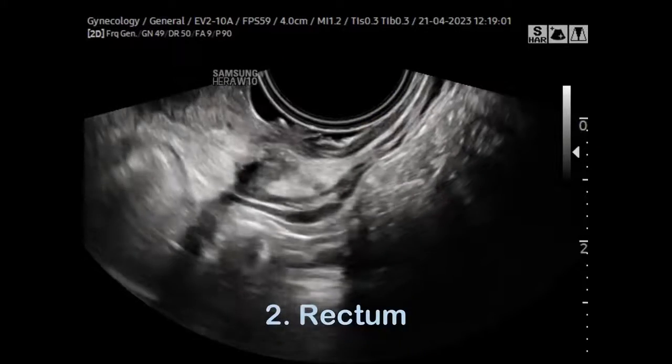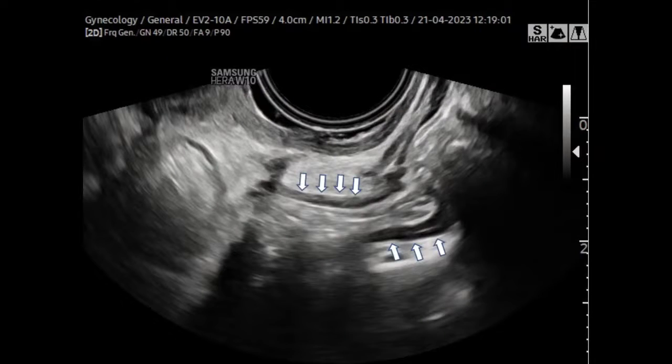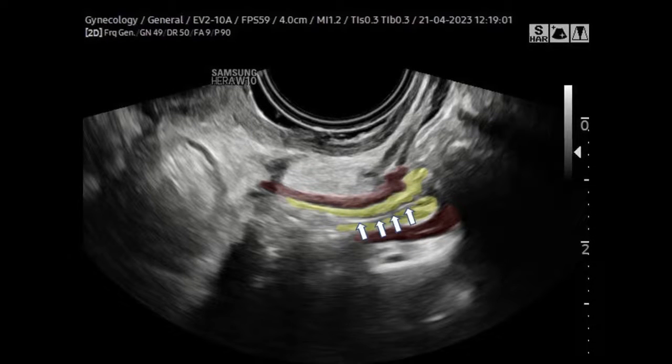The serosa, or outer layer of a normal rectal wall, as seen in this image, is identified as a white millimeter-thin line, followed by a thicker dark gray muscularis propria layer. Underneath the muscularis, you will find the lighter gray submucosa and ultimately a thin white line depicting the mucosa. So how do we improve our visualization?